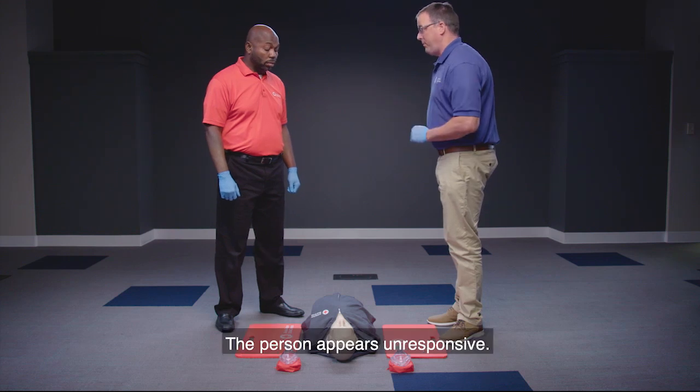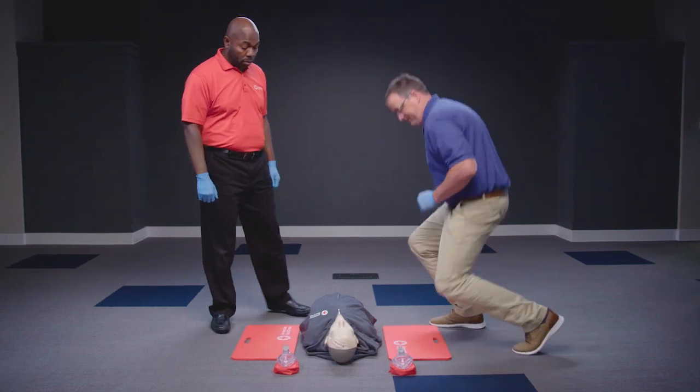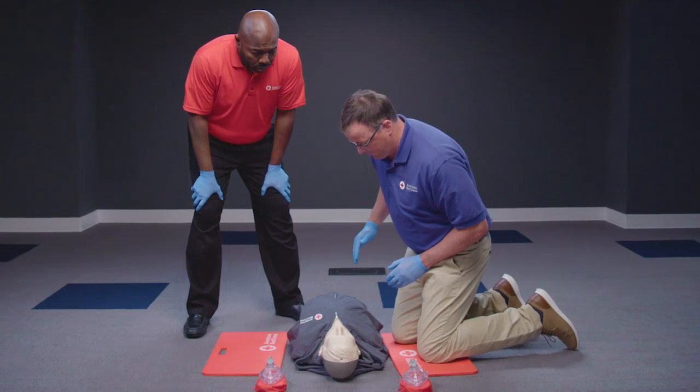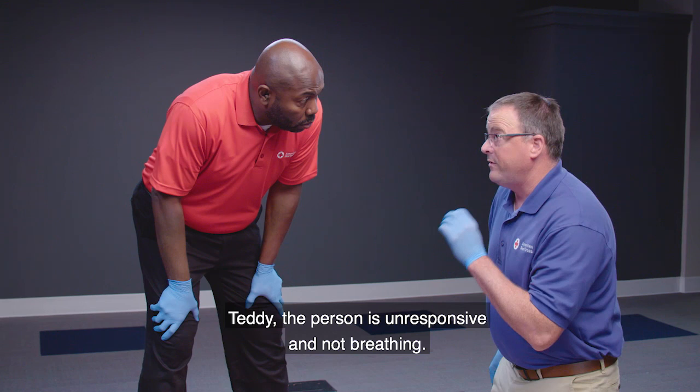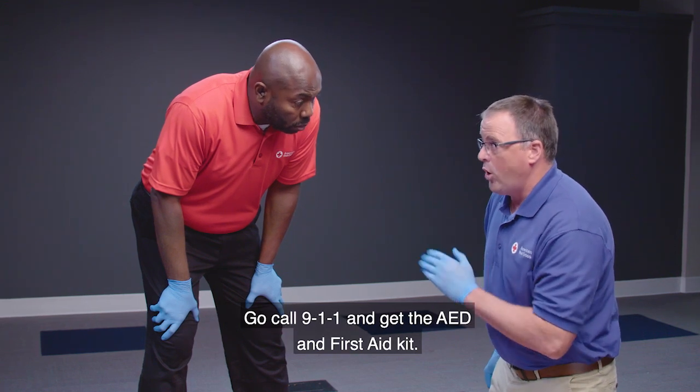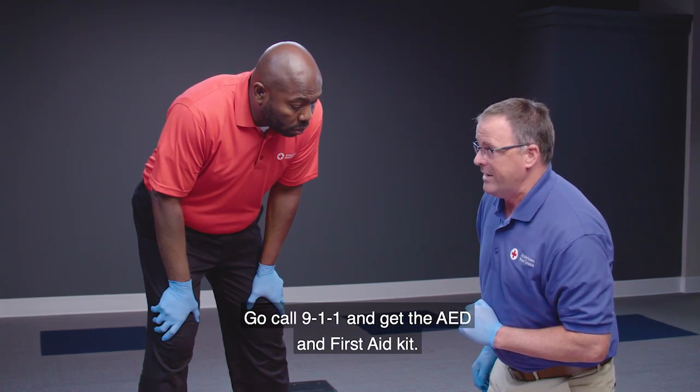The scene is safe. The person appears unresponsive. The responder checks responsiveness, calling out 'Sir? Are you okay?' and determines the person is unresponsive and not breathing. The second responder is directed to call 9-1-1 and get the AED and first aid kit.